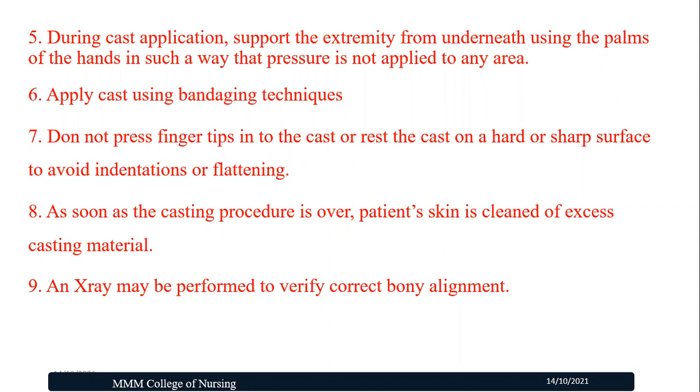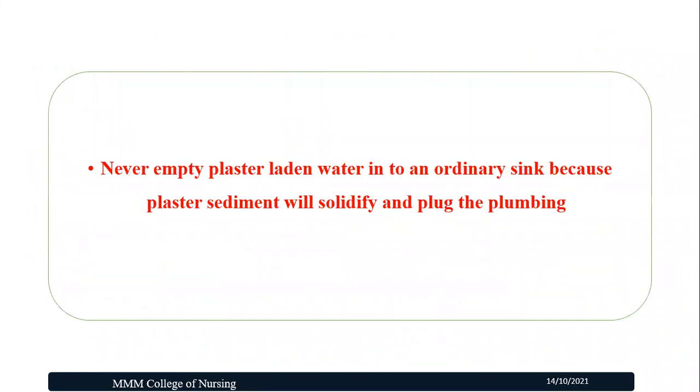As soon as the cast procedure is over, the patient's skin is cleaned of excess casting material before it dries. An X-ray may be performed to verify the correct bony alignment if closed reduction was performed. Here, as nurses, we need to remember one important point. That is, after application of the POP, never empty the plaster laden water into an ordinary sink, because the plaster sediments will solidify and plug the plumbing of the sink, and we need to take extra care during this process.